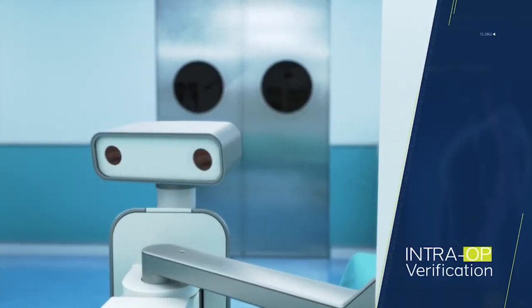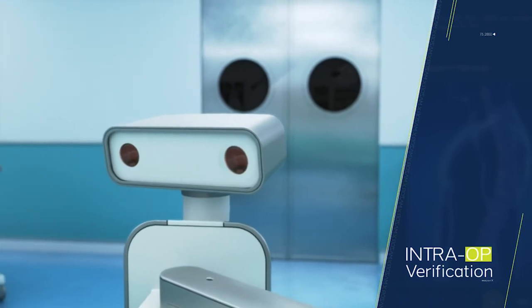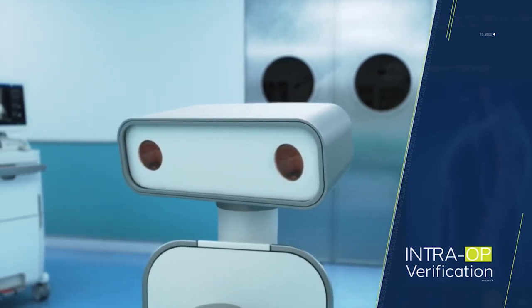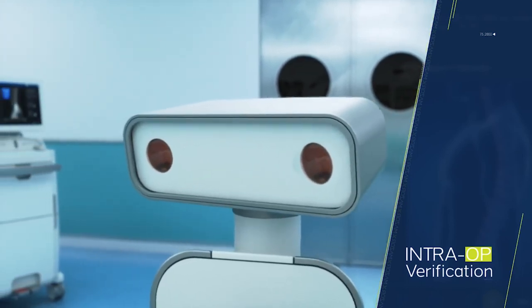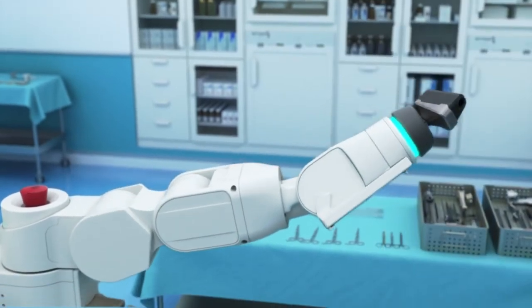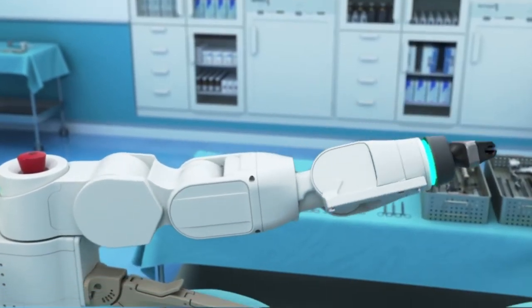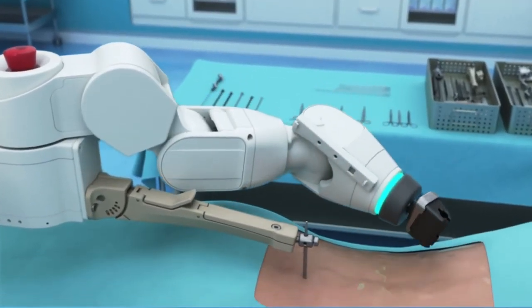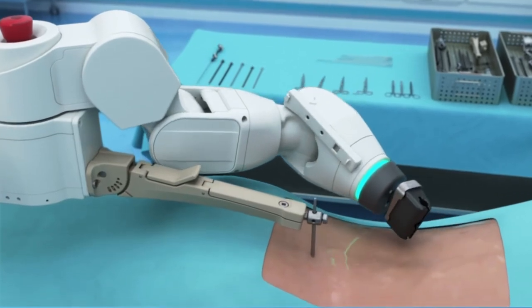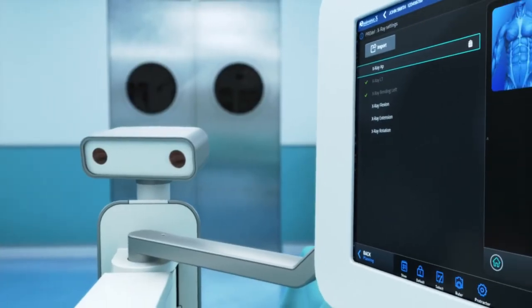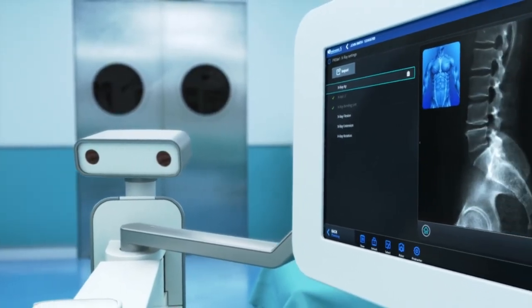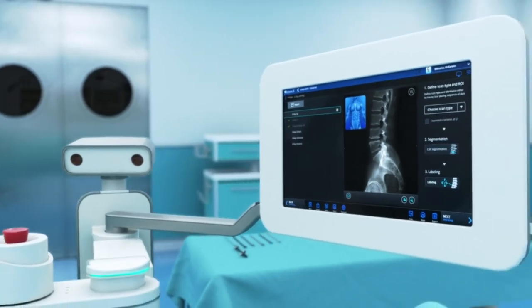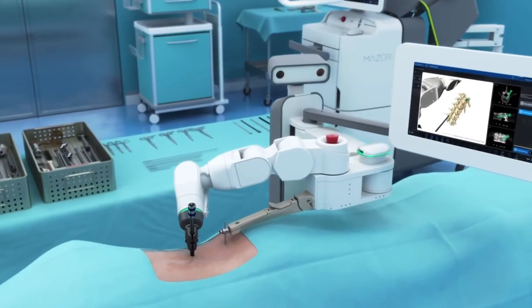Intra-op verification uses the MZOR-XI, an integrated 3D camera with spatial tracking. The software guides the surgical arm into position, translating the surgical plan to precision guidance in the surgical field. Before instrumenting, the MZOR-XI camera provides intra-op verification of the surgical arm position.